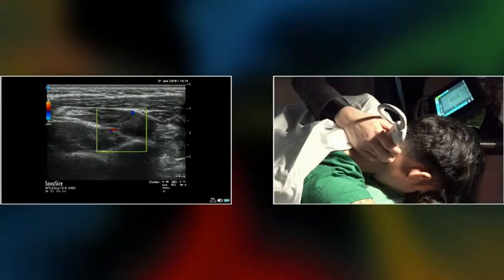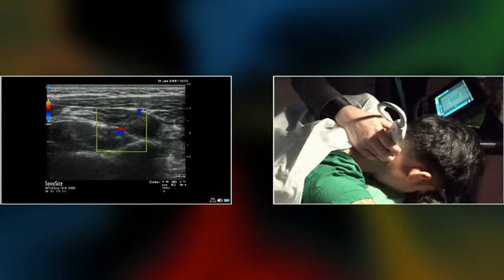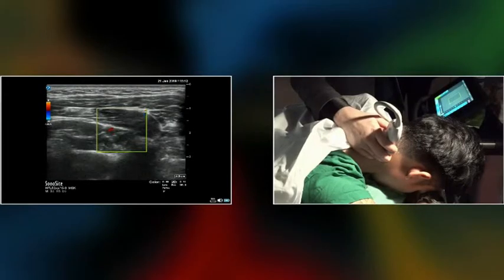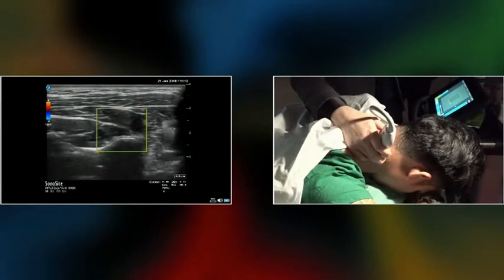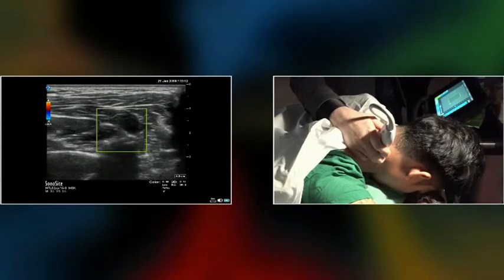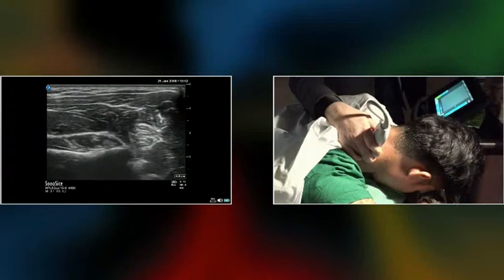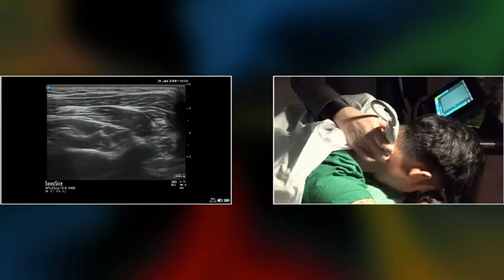and then you detect the artery, the occipital artery. And if you cannot see very nicely, then you can scan down. You see actually the nerve. We take off the color first. Sometimes with the color Doppler, the echogenicity is more difficult. So we try to see if we scan up and down, whether we can trace.